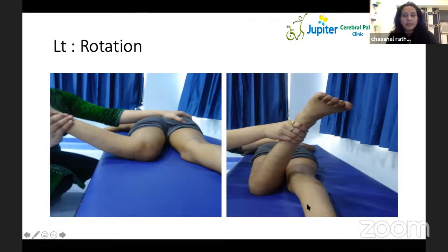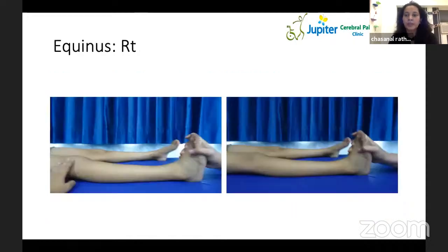If it is less than 35, then yes, it is significant. Otherwise, it is not significant, and probably the body might compensate to get a neutral foot progression angle. But when such a combination exists, it is difficult for the body to get a neutral foot progression angle, and the child might continue to walk with intoing.